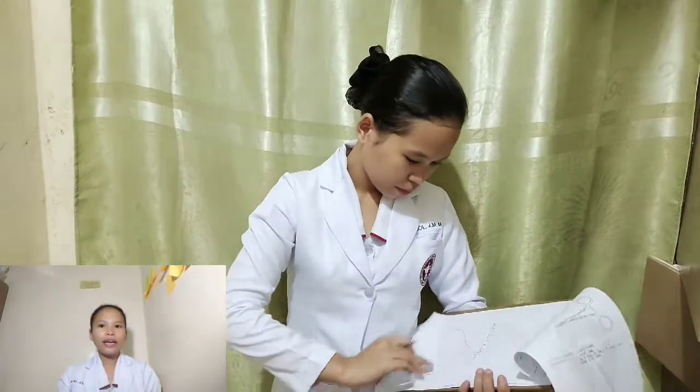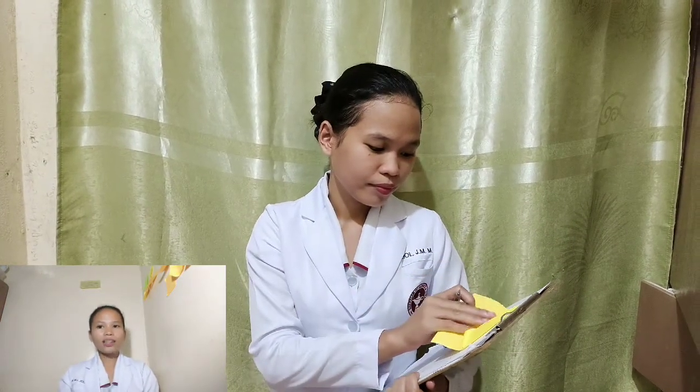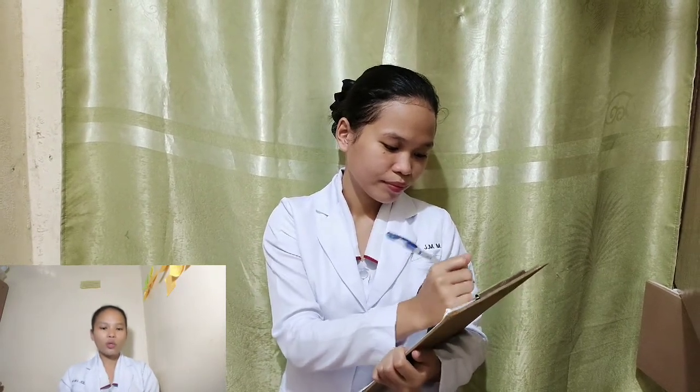Record the amount of fluid infused on the input or output record sheet and on the chart if necessary. Include the type of solution used, time, and reason for discontinuing the infusion and the client's response. This ensures accurate documentation of the client's response.